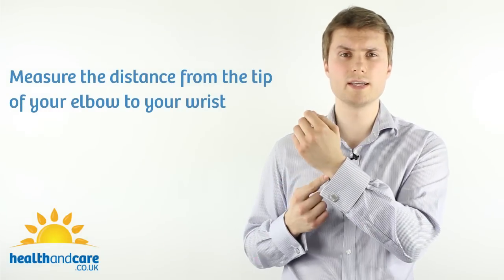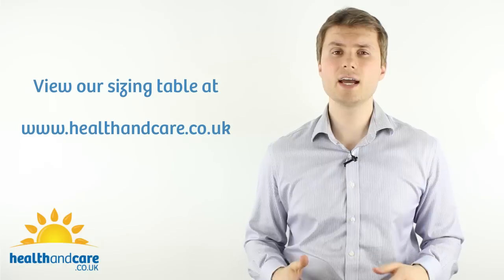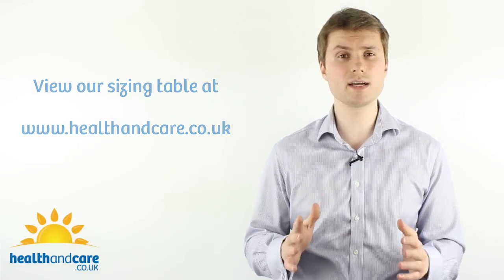Some arm slings require you to take a measurement from your elbow to the base of your little finger, but with the Cotton Arm Sling it's crucial to take a measurement from the tip of your elbow to your wrist. Then you can visit our website www.healthandcare.co.uk and compare it with our sizing table to get the right size for you.